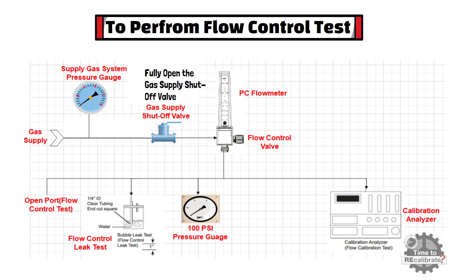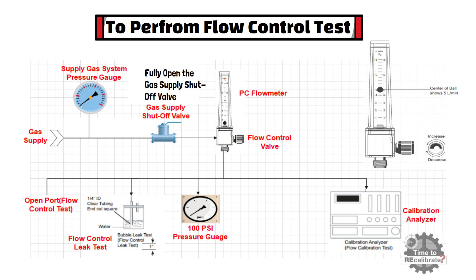Now set a flow rate — for example, set the flow rate to 5 liters per minute — and observe that the ball maintains a steady position for several minutes. If the ball maintains a steady position for several minutes, the flow control test is passed. If it does not maintain a steady position, there is some issue with the oxygen flow meter and it is not recommended for regular operation. In this case, the flow meter needs to be sent to a service center for further investigation.